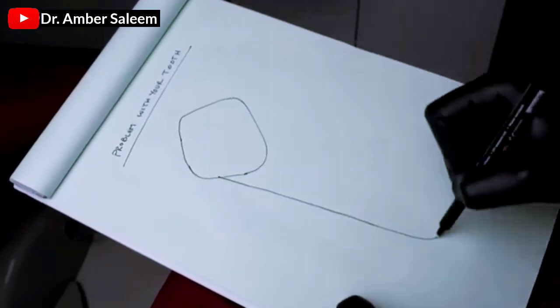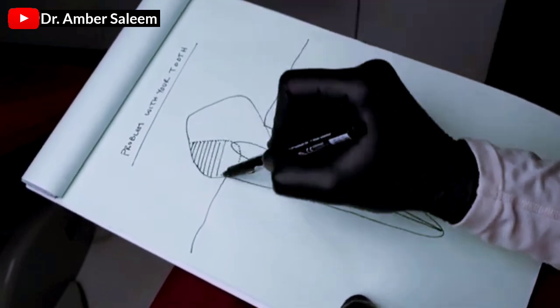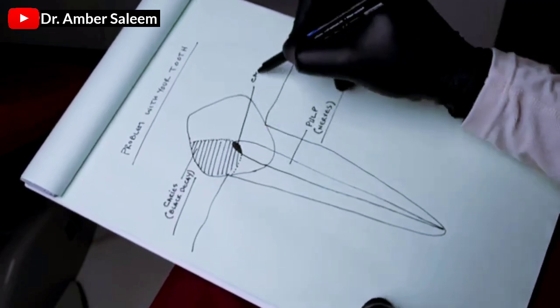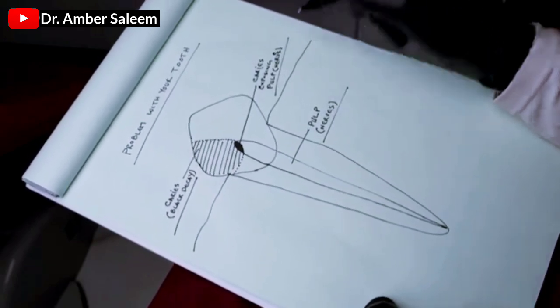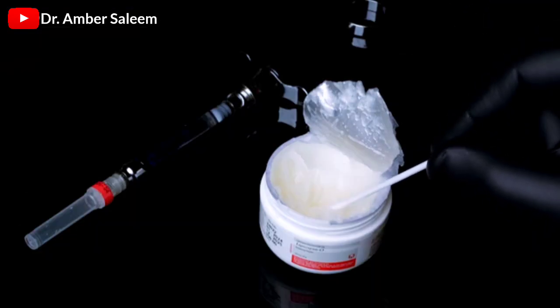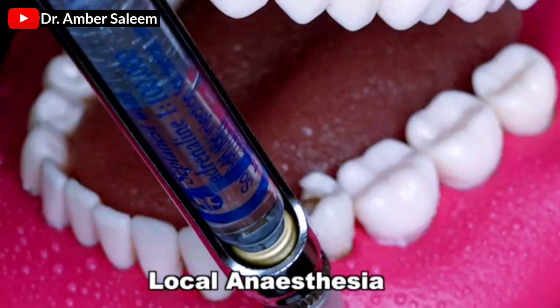Patient education. Topical anesthesia for painless injection. Local anesthesia.